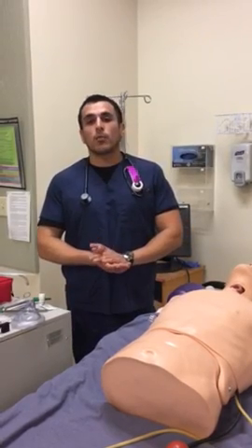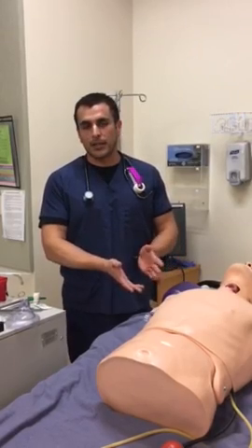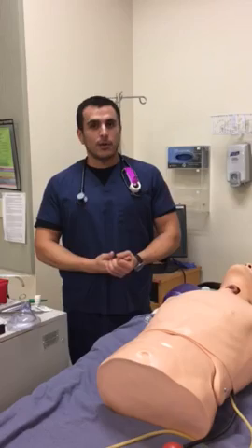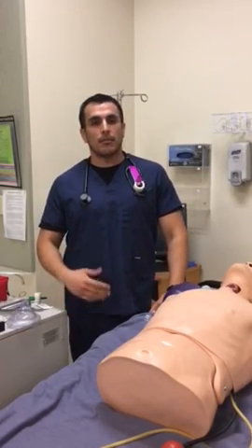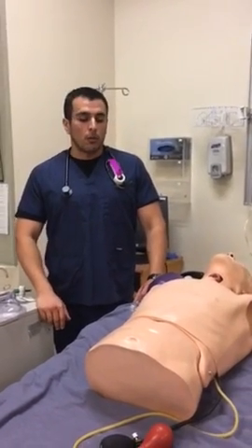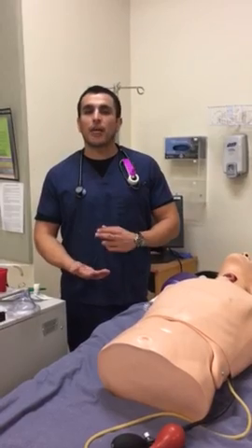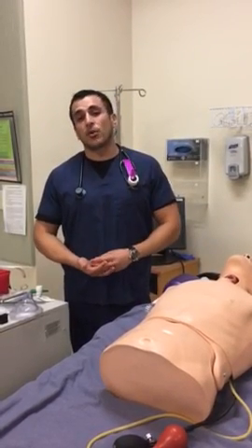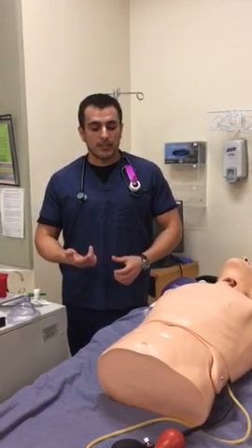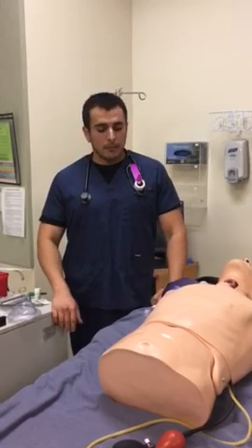The second thing we would want to do, in this case the patient is going to be getting an elective surgery, is explain the process of intubation to them. We would also want to check the patient's past medical record for any other intubations in their past. What we would be checking for is things like, were they a difficult intubation? How many attempts did it take? Were they a difficult wean, so to come off of a ventilator, how hard was it? What size tube were they? Where was it placed? Just things like that.